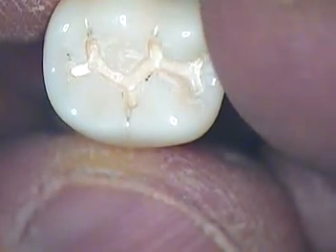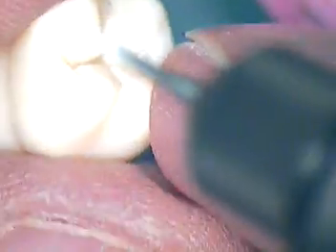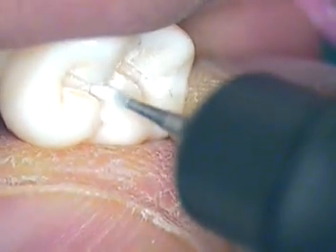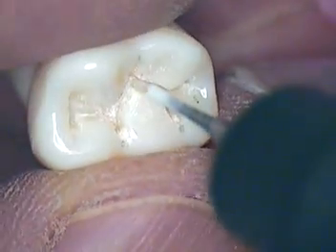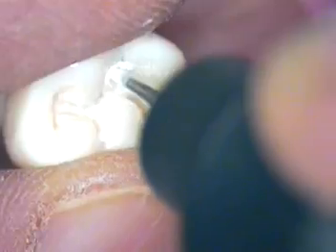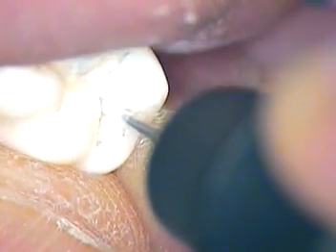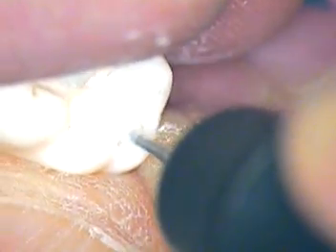Almost finished with our Class 1. You can now go in and actually start to round some of these little line angles and wall areas. I'll start working on this one a little bit, staying parallel, right in here — just where these little elbow areas are. Just keep working on it. It takes a lot of practice.